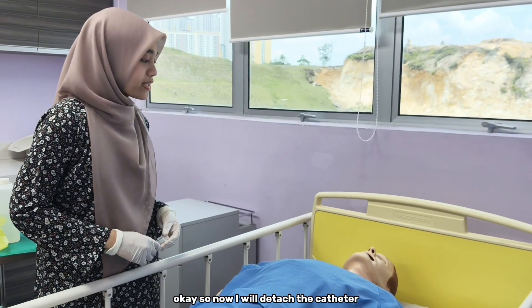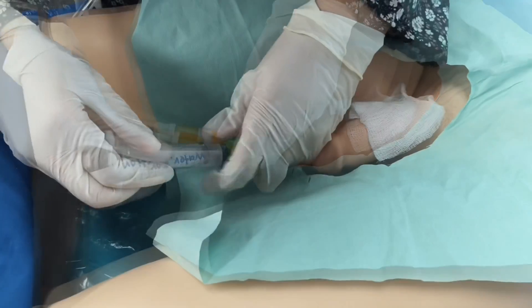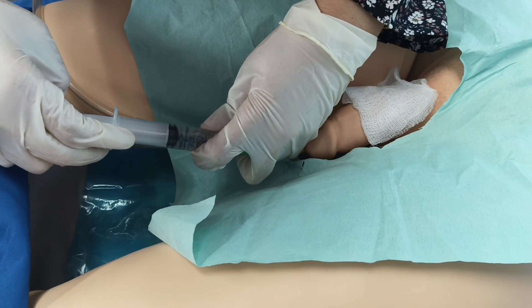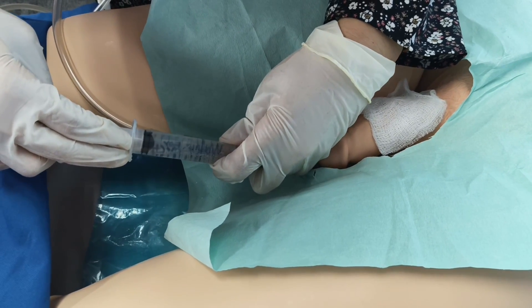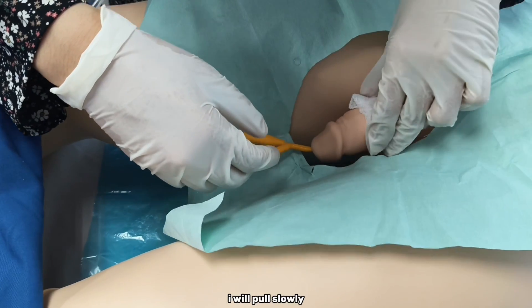Now I will secure the catheter. First, I will pull the water out using this syringe. I will pull slowly.